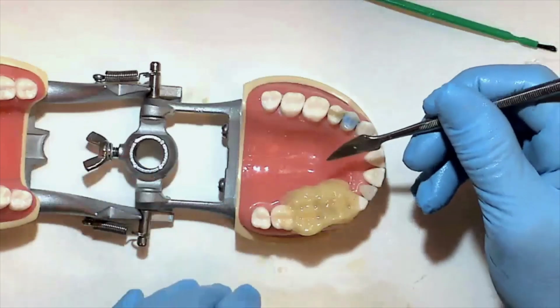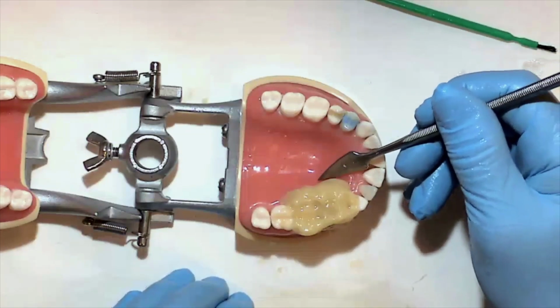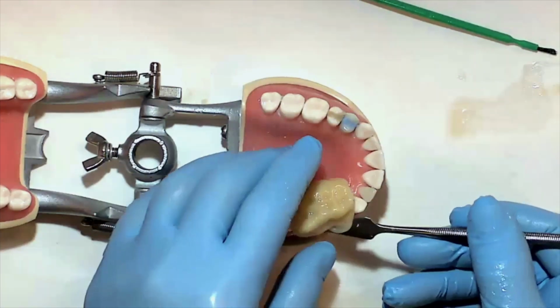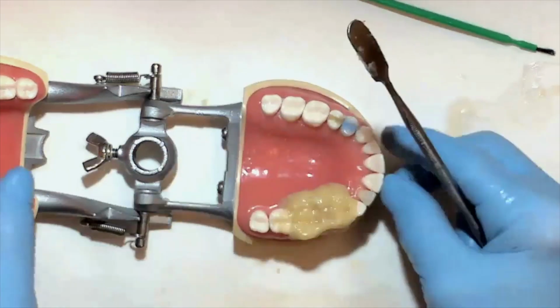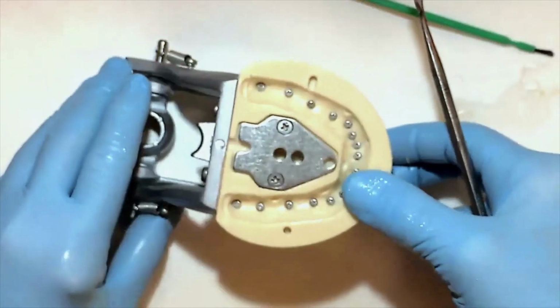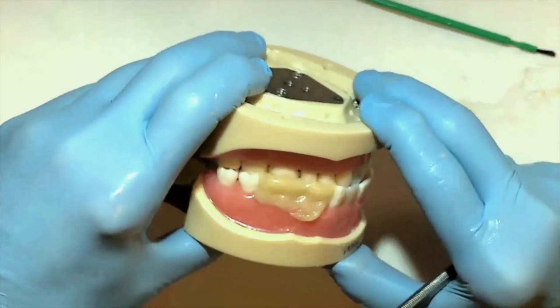While the acrylic is still in the doughy stage, we don't want to remove it, but once it gets into kind of a rubbery stage like you see here, we can remove it and then replace it. This helps ensure that you won't get locked into any undercut areas on the adjacent teeth. So we'll close it again, we'll wait a little while longer, and then remove it again.